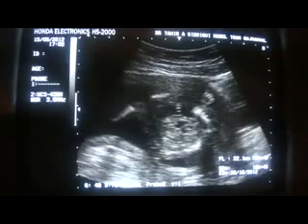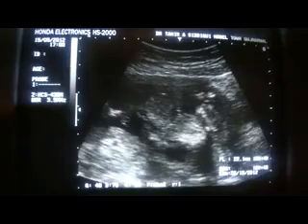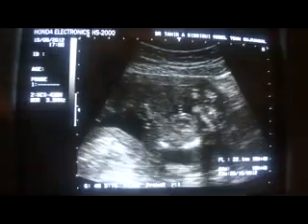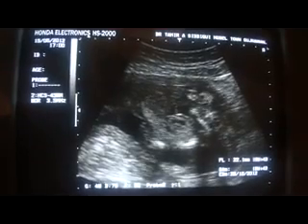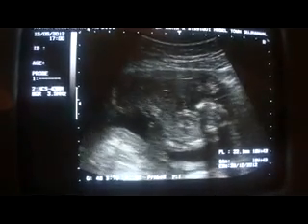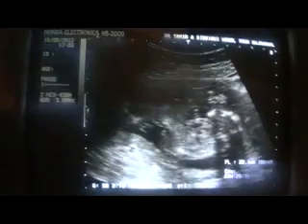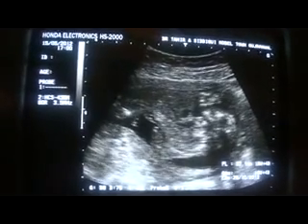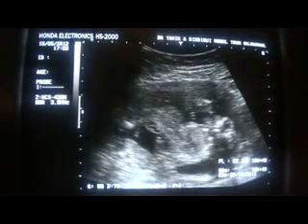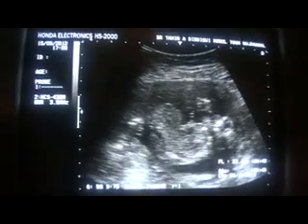The cord is normal, 2 arteries and 1 vein in transverse section. So it's fine with the umbilical cord. This is the face.